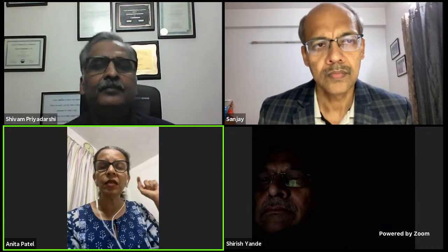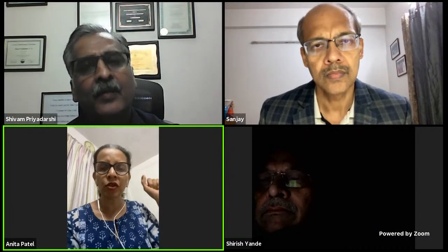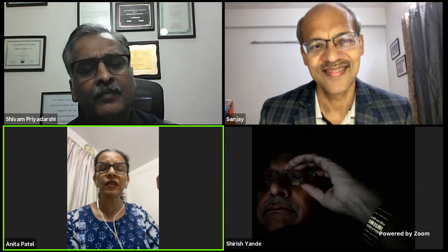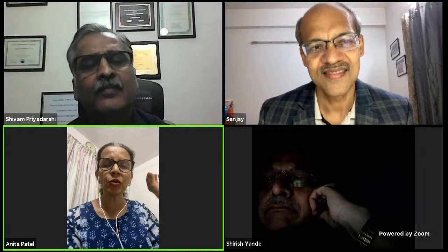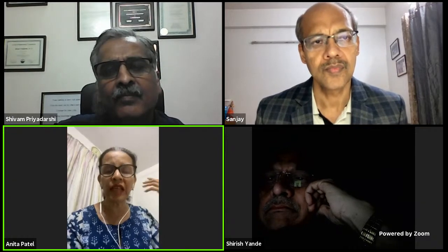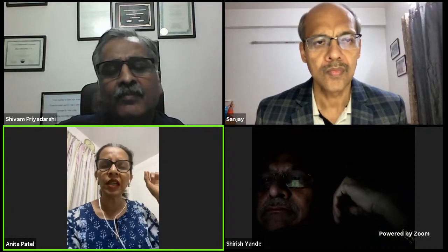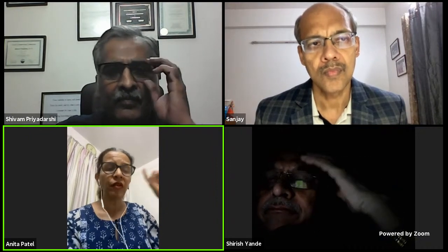Now, this is where in pediatric practice, this may be the only situation where I may want a little sedation. I'm sure both Sanjay and Shirish would agree, because to have a child who's exceptionally cooperative, not moving, so that we get excellent images during a urodynamic can be a little tricky. In pediatric practice, it is the storage phase that we are extremely concerned about. And in that, we don't need a child who's conscious and is aware and volitionally voiding on command. In fact, in many pediatric situations, we don't need the voiding cooperation so much. And this is where I may want a little sedation so that I get good imaging while the urodynamics is going on. So that may be one situation.